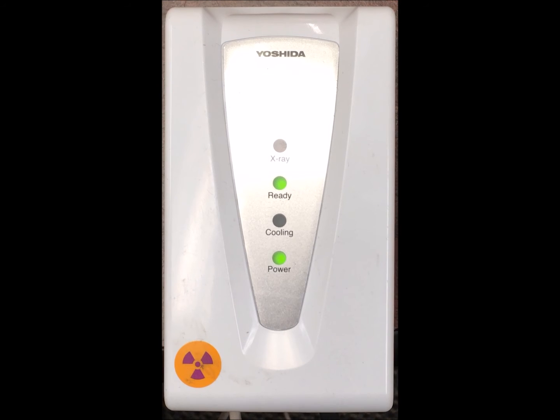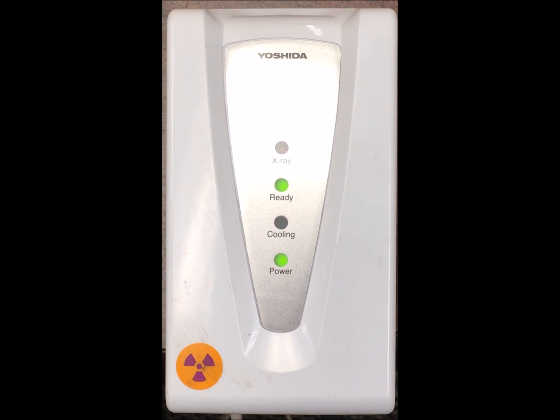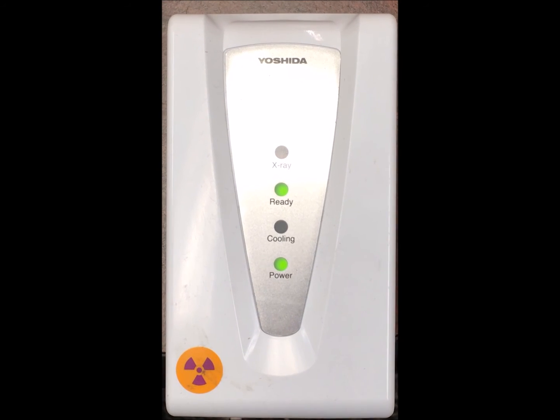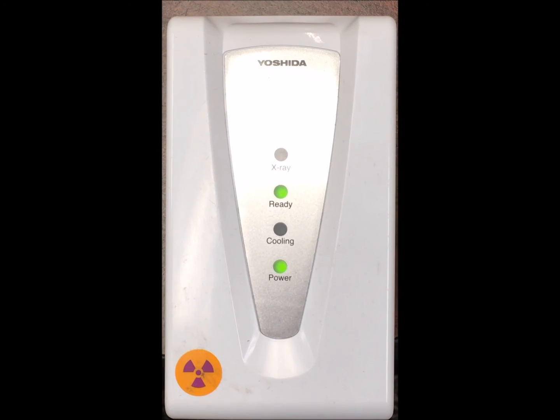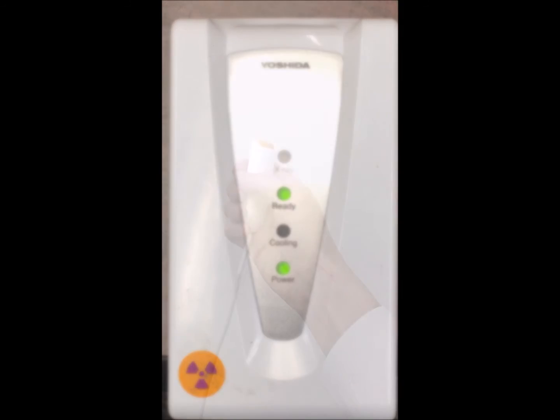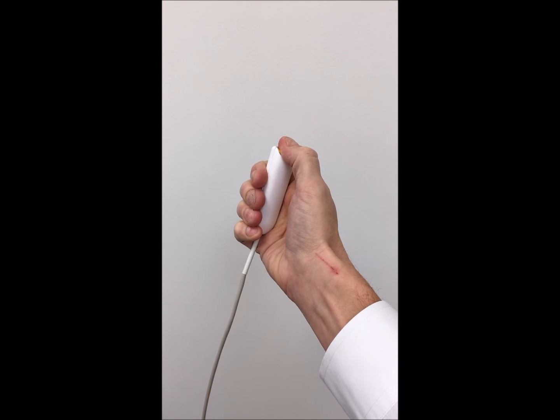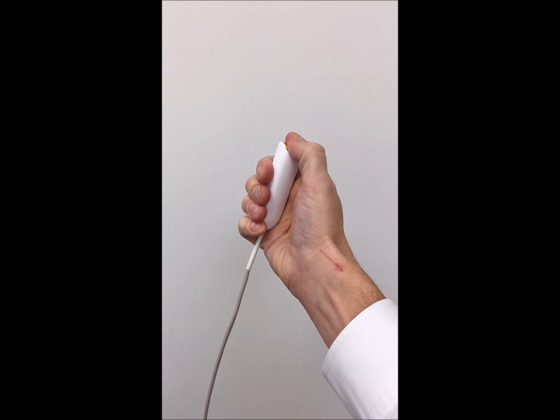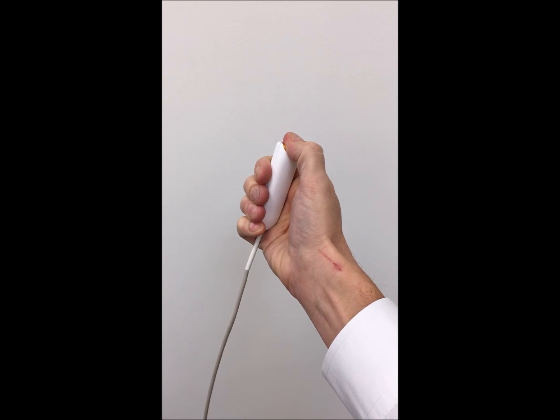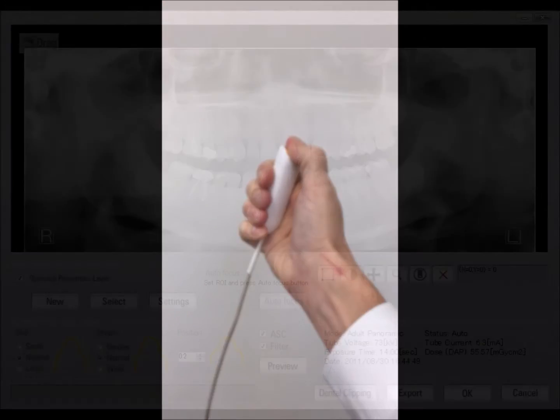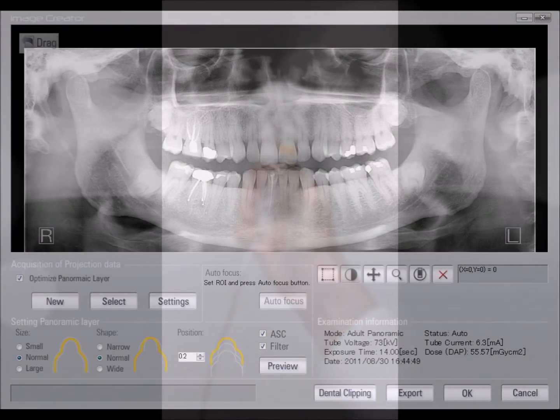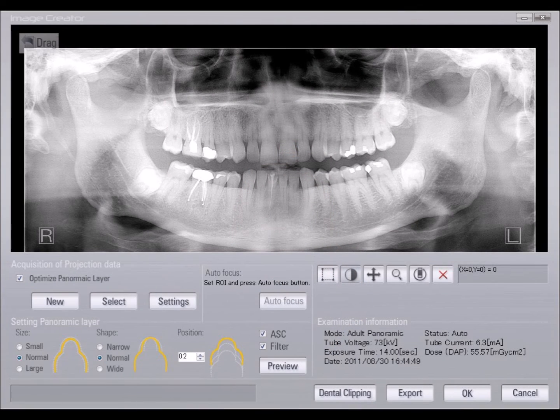Then instruct the patient to swallow, place the tongue on the roof of their mouth, and hold still. Then press and hold the hand switch during the entirety of the scan. As the scan is taken, you'll see it appear in the preview screen.